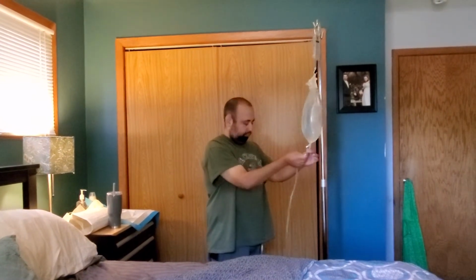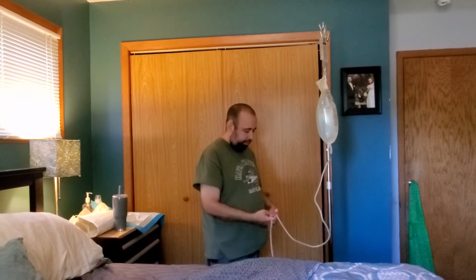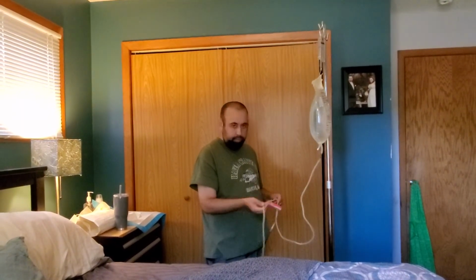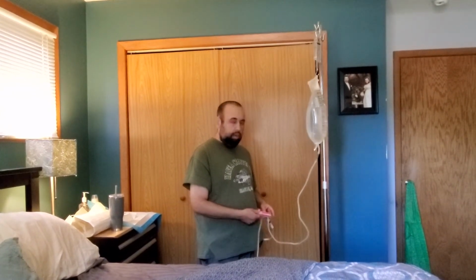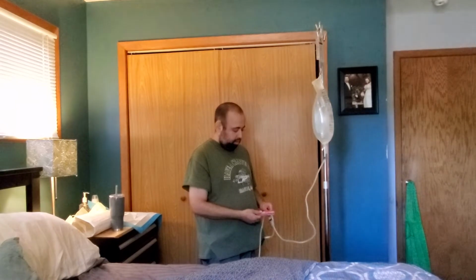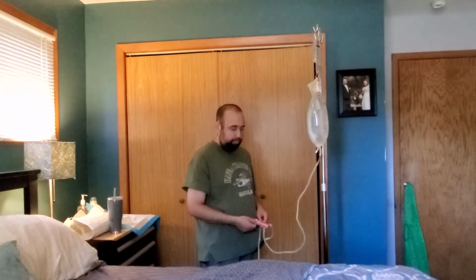And that just releases the solution down into the tubing. Yep. So then I need to take this clamp and move it down to the drain line so that there's no air. The air won't cause damage, but it'll be very painful if it gets into my abdomen. So what I'll do is I'll undo this, count to 5, place it on the drain line, and then I should be good to start filling.